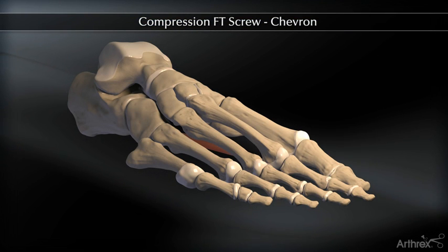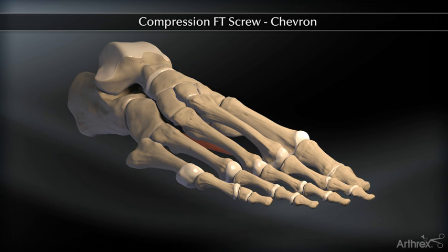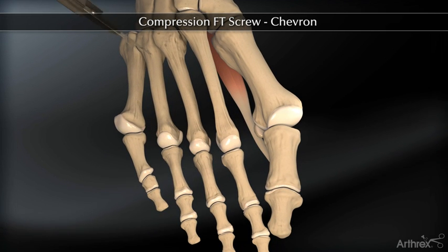The Arthrex 2.5 micro and 3.5 mini compression FT screws can be used for various osteotomies of the forefoot and midfoot. We will be highlighting the chevron and scarf osteotomies in this animation.